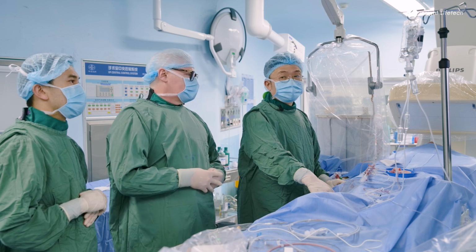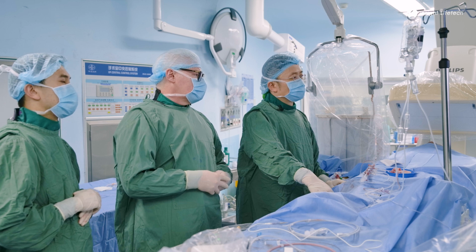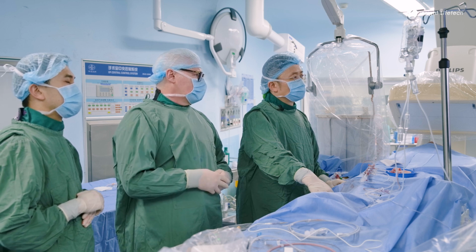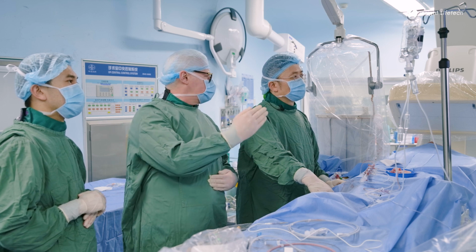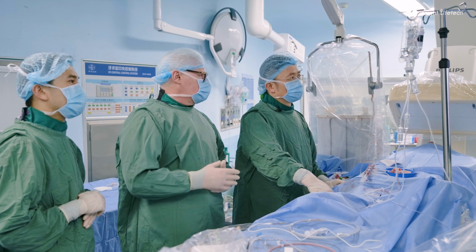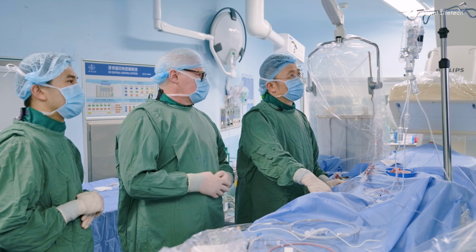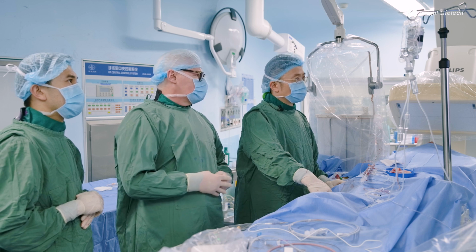And then distally, there is no ischemia there, but the more important thing is that when we do pullback, we have no significant gradient all along the stented segment of the vessel. There is only some residual gradient across the ostial LAD, which is not tight, and there is no need to intervene now and to do left main stenting on that vessel.